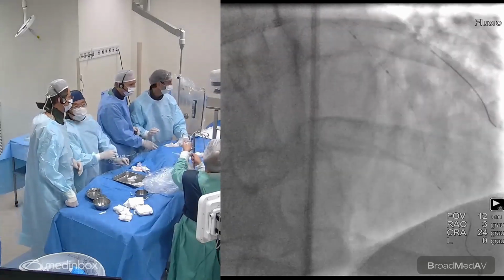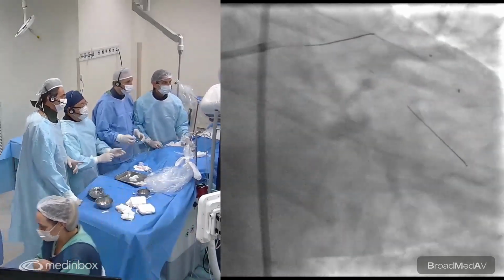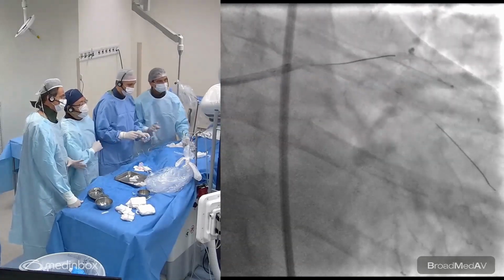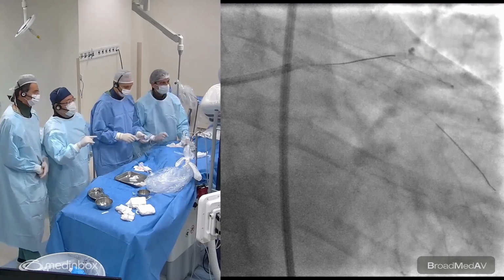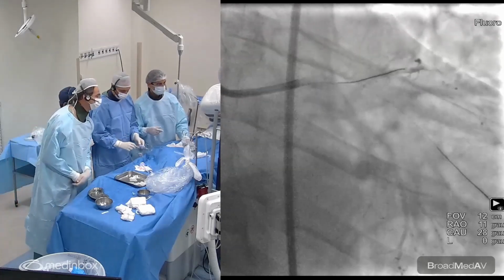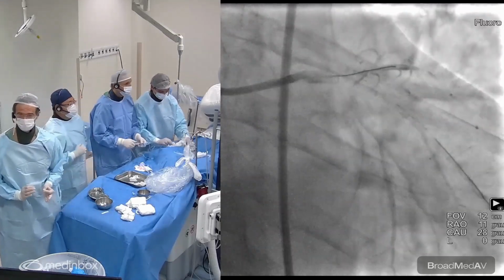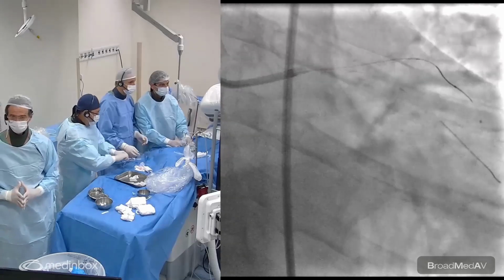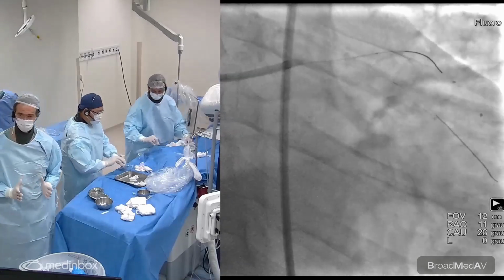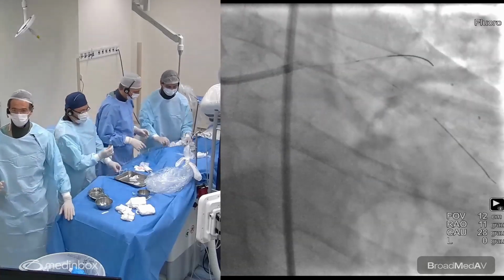What are you doing now, Ricardo? Just measuring. Are you going to inflate the balloon again? No, we are using the tip of the radiopaque guide wire, so you can measure how much length of the stent. So perhaps 33. Thirty. 38 to go all the way back there. Okay, so we are now using the tip of the wire just to see the extension of the lesion, to be precise. He brings back the wire, leaves the balloon distal, and injects contrast. And measure the lesion, as you can see here, with the contrast injection and the wire.